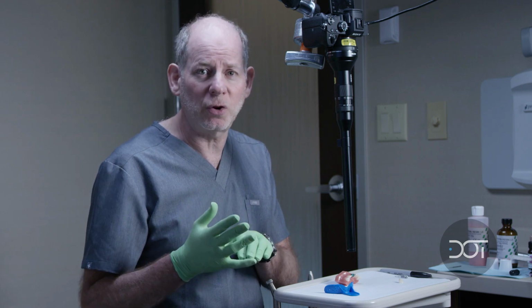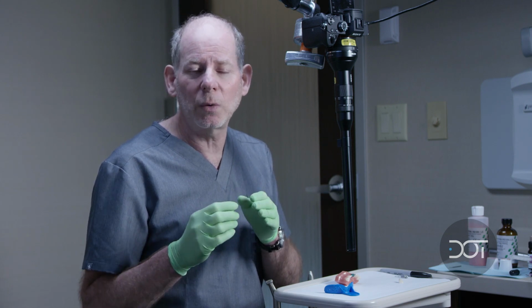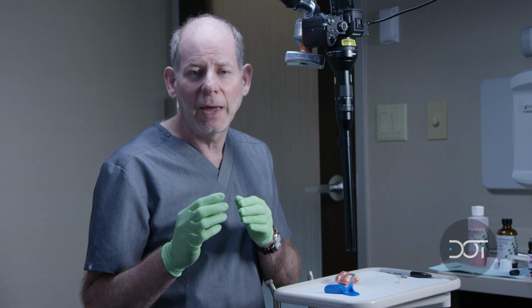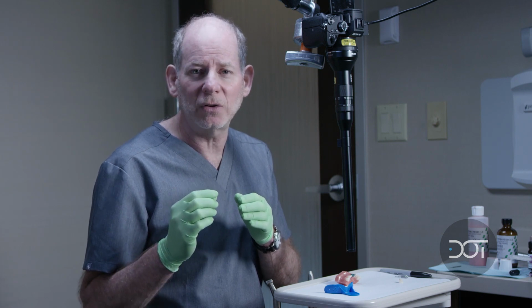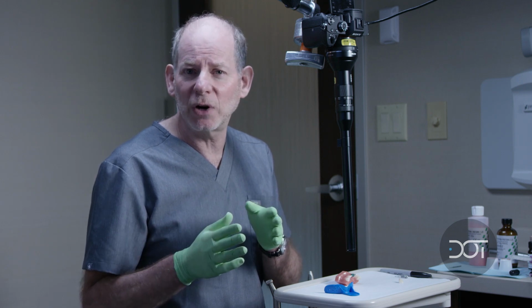In today's world, we have three ways we can take impressions of our implants. We can do an open tray impression technique like what I'm going to share with you now. There's also a closed tray technique, which I will typically use when I'm working with somebody who has a very small mouth and where I'm working into the back of the mouth, and it's hard for me to get in and be able to use this open tray technique. But for an analog impression, I prefer to use this open tray technique.